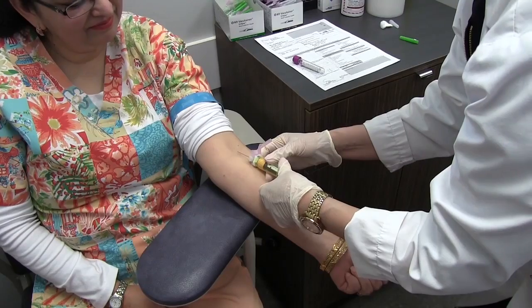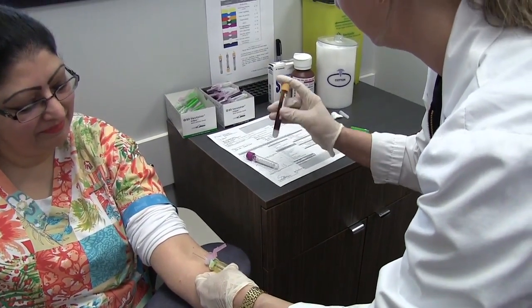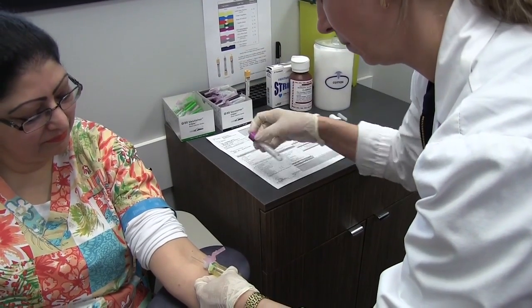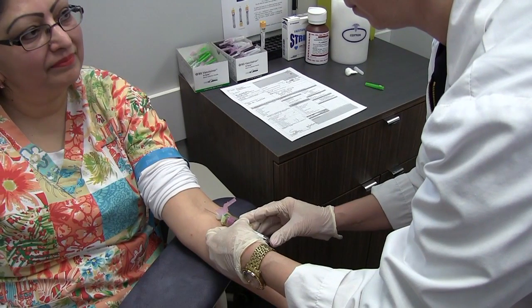When good blood flow has been established, remove the tourniquet. Change the tubes smoothly without moving the needle, and immediately after each tube is filled, gently invert the tube with the correct number of inversions.